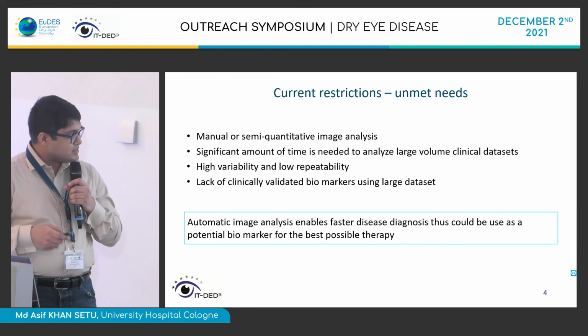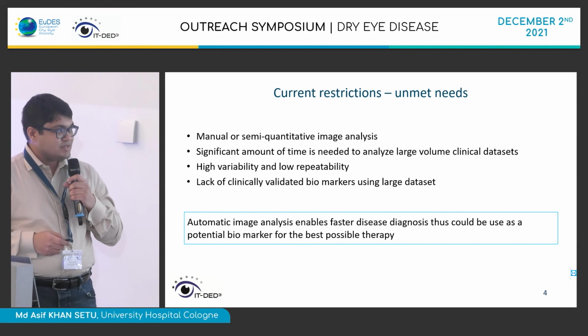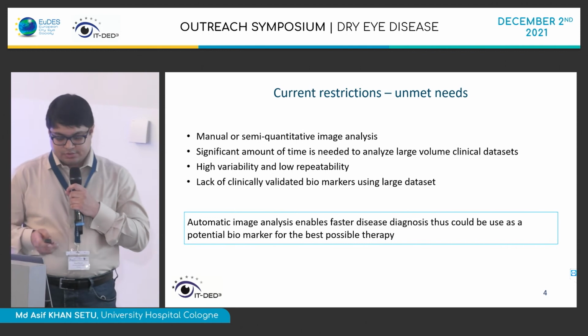So we hypothesized in our project that automatic image analysis could enable faster disease diagnosis, which could be used as potential image-based biomarkers for the best possible therapy.